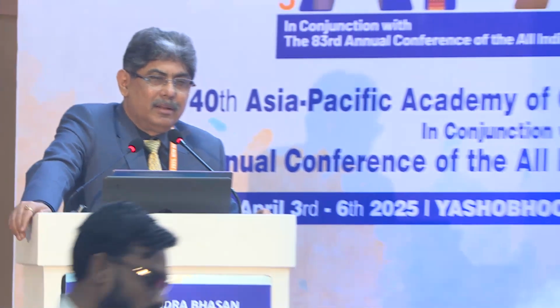Sir, it is going to prevent further spread, no? Yes, sir, you are right. The red glow will be affected, but it doesn't make any difference. This happens mostly with us, where we do dye staining a lot of times in complicated cataract. So it is possible that dye goes behind into the vitreous, but I think it is harmless. Only the red reflex is affected. The rest of the technique will remain the same.